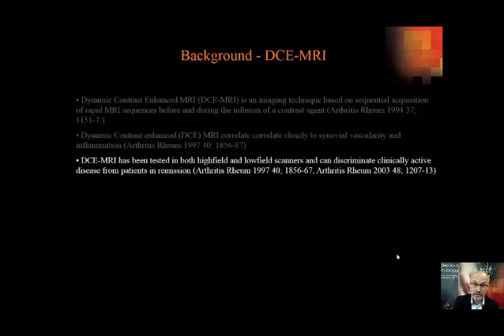The dynamic contrast enhanced MRI also in the 90s was shown to correlate with the synovial vascularity and inflammation, and here in particular it was the slope of the enhancement curve. They also have been tested in both high field and low field scanners and have given clinically meaningful information, and were able to separate patients in clinical remission and those with clinical activity.